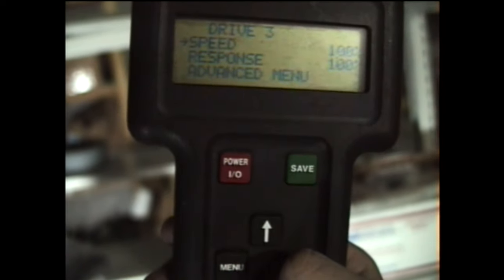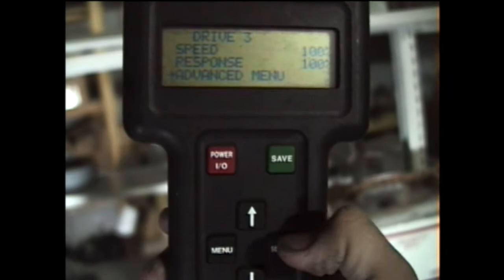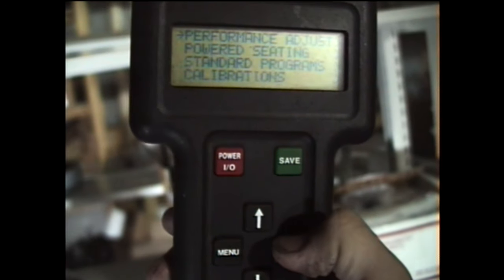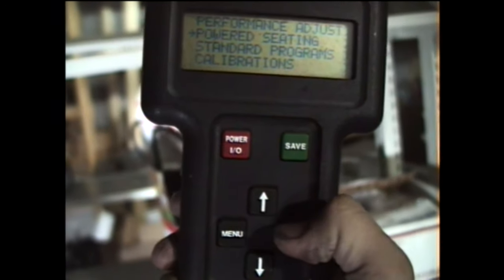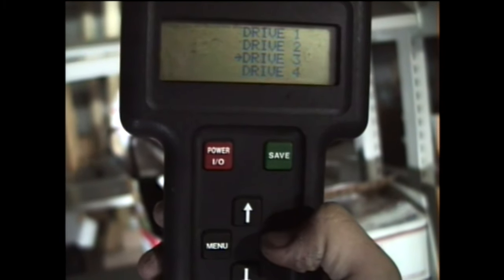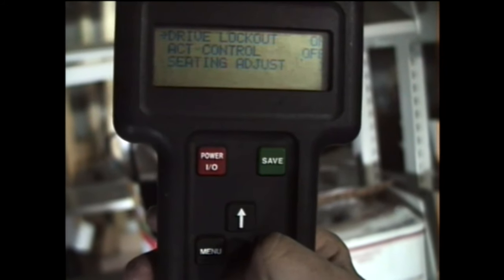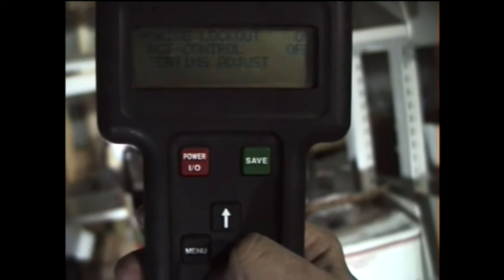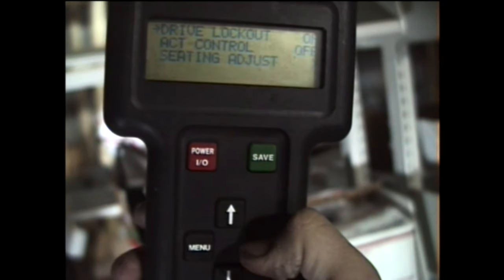Go into the advanced menu and press Enter. Go down to Power Seating and press Enter to select. We're in Drive 3, so go to Drive 3 Drive Lockout — you see it says On — click the Select button.